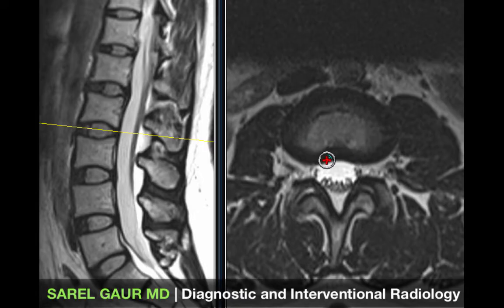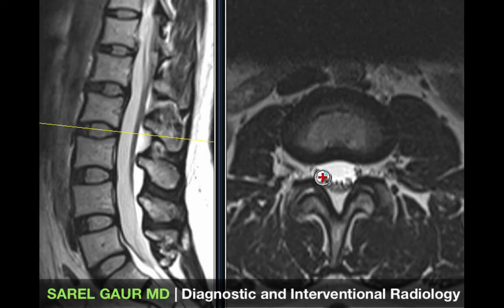Posterior to that I see a round bright collection which is the spinal canal — the dural sac containing the individual nerve roots. This would be called the cauda equina at this level.